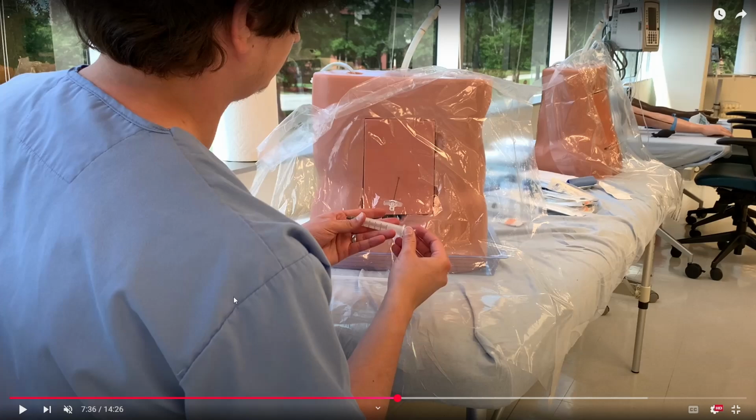When you're pushing through skin and tissue, you will be fighting the resistance. The syringe will not collapse. However, once you enter the epidural space, it is a potential space within the spinal column, and it can fill with air or saline. So the moment the syringe collapses, you know that you have entered the epidural space. That's why we use the loss of resistance technique, because it tells us, hey, we've exited the tissue, we're now in the epidural space.